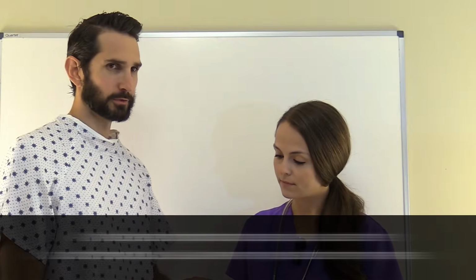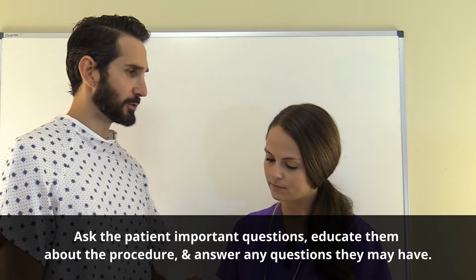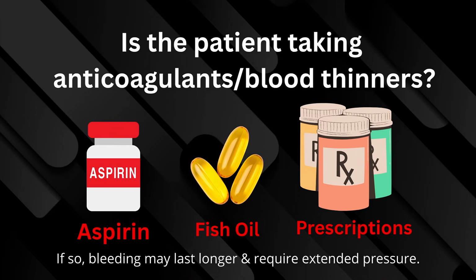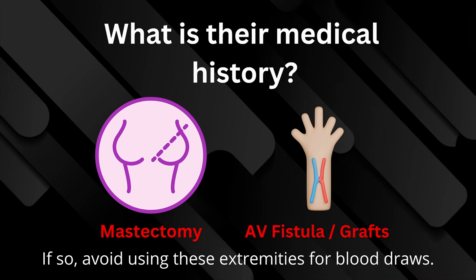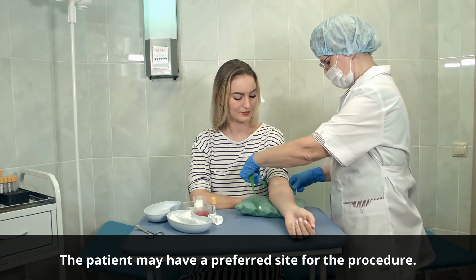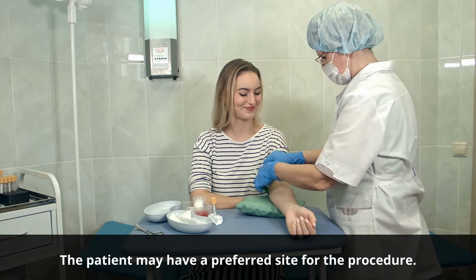Next, you want to take some time to ask the patient some important questions and then educate them about the procedure and answer any questions that they may have. So some important questions to ask would include allergies. Are they allergic to latex, alcohol, adhesives? Are they taking any anticoagulants? Do they have a history of a mastectomy, AV fistula, or grafts? And how do they tolerate blood draws? Along with, do they have any preferred site that you should use to actually draw their blood? Because many times patients know which veins are the best.